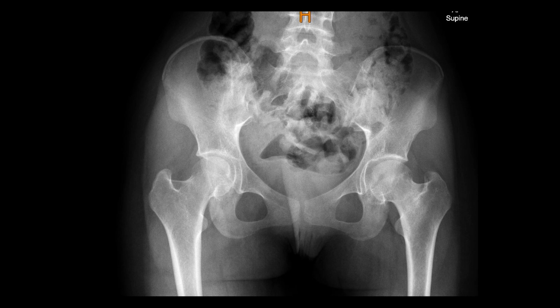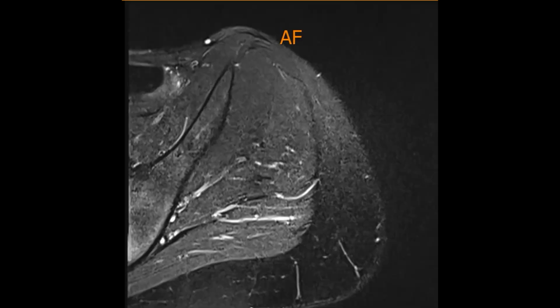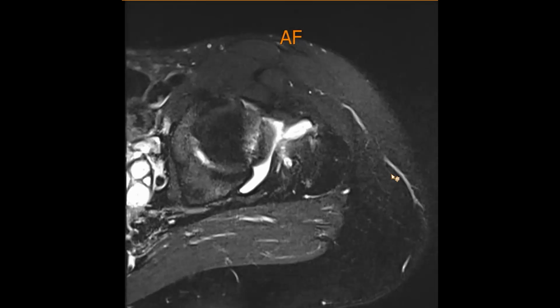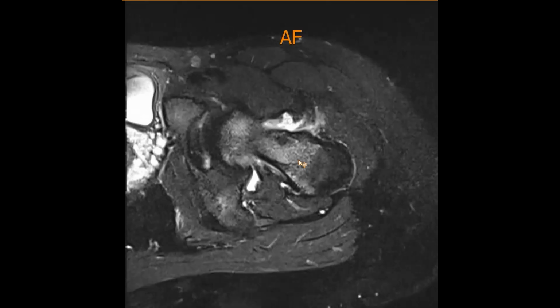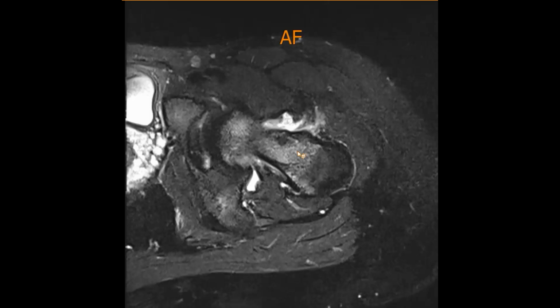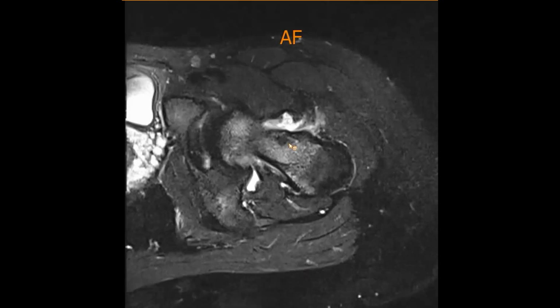Plain X-ray was unremarkable. You cannot see anything. There might be some sclerosis where the lesion is, but otherwise it's essentially normal. The MRI scan showed high signals within the femoral neck and some joint fluid, as you can see in this video. And here I'm pointing to the edema of the bone. There's some bone thickening at the front, as you can see in these dark signals, and there's a slight hole, as you can see here, which is where the nidus is.